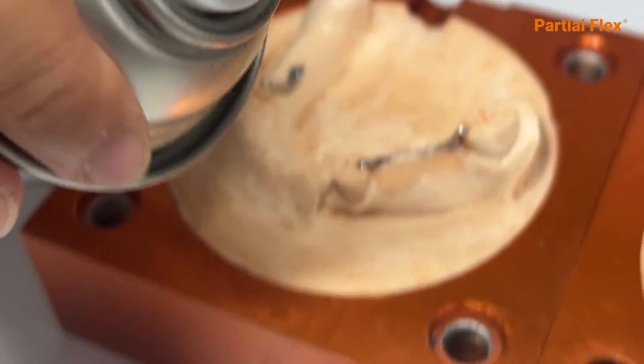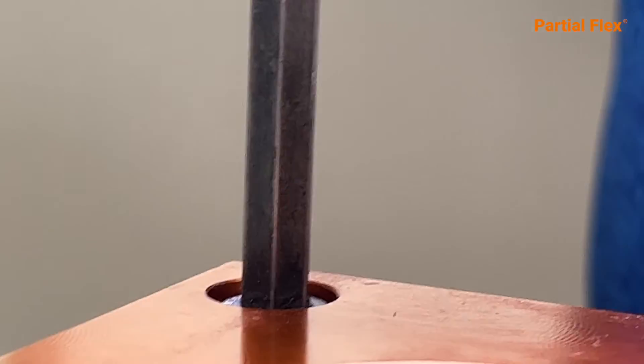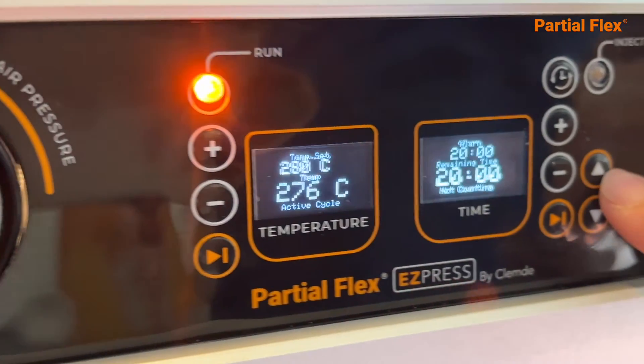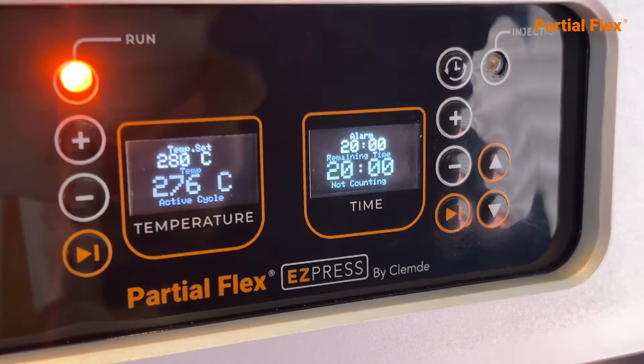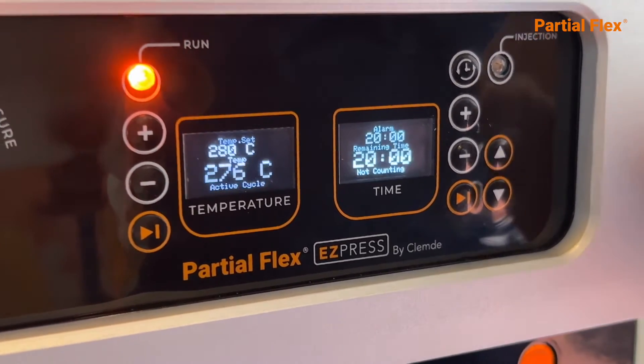When the second layer is dry, apply Molding Flex. Seal the flask and put in all four screws. Program your Easy Press machine. Set at 280 degrees Celsius for 20 minutes and your injection machine will be ready to use.